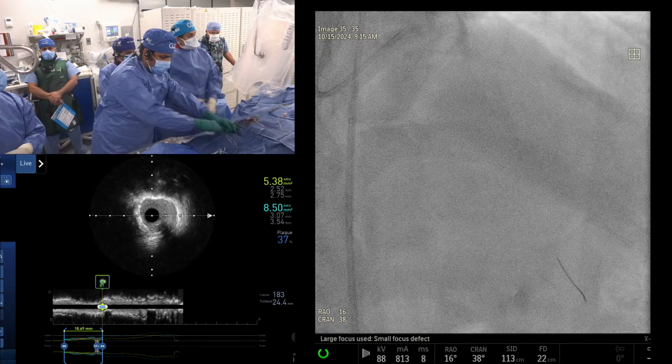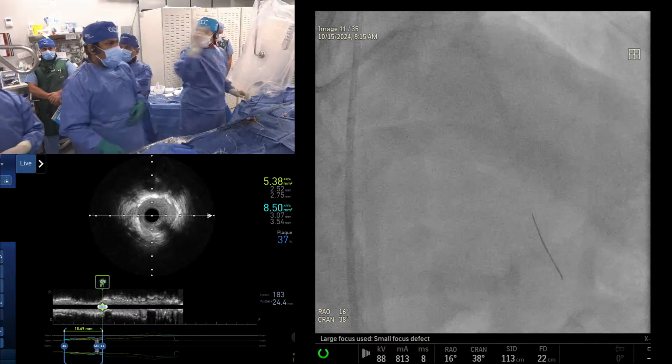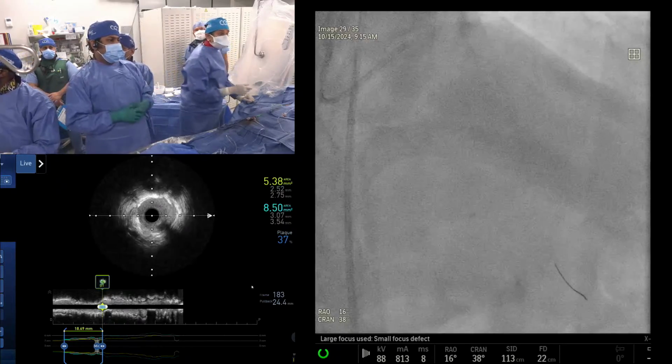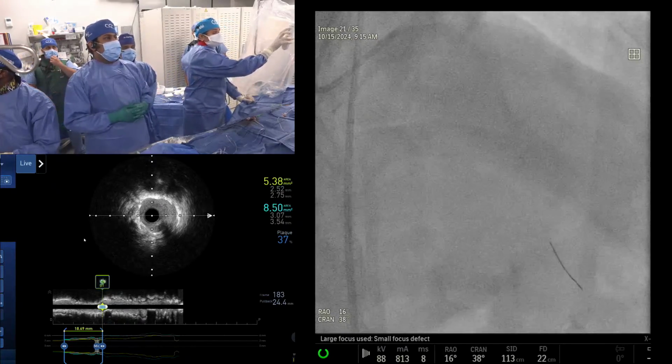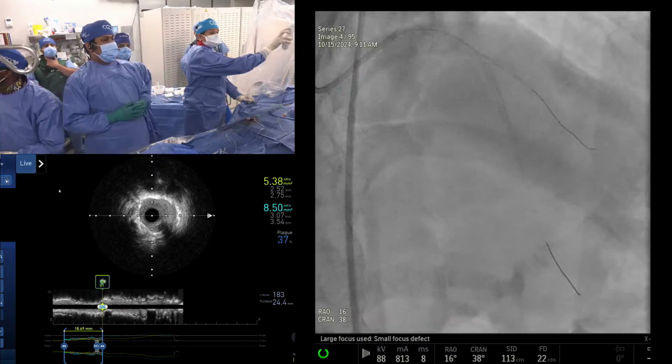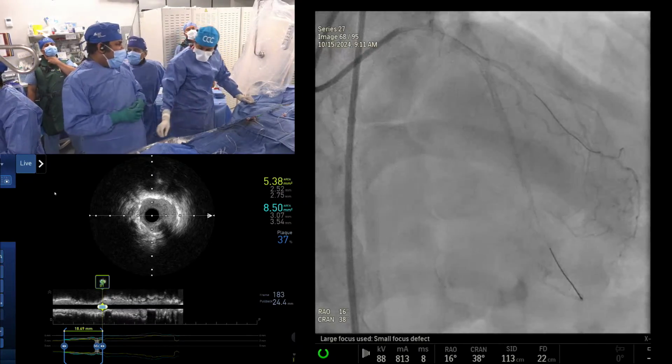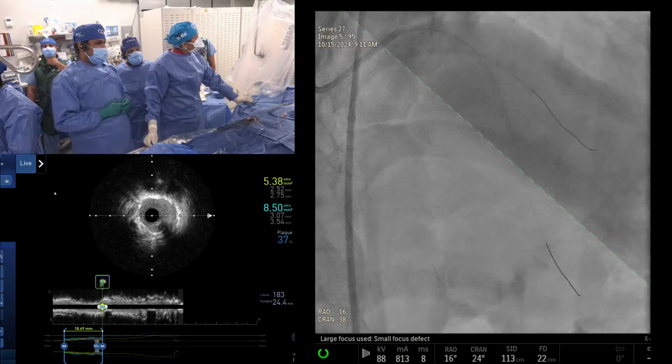So let's finish it now. And you tell us whether drug balloon or not. Ostial diag is 5.0. It's very exciting. Very good. Only question remaining: drug-coated balloon or no drug-coated balloon? Another $5,600 expense or not? Probably not. To me, we would leave this alone.